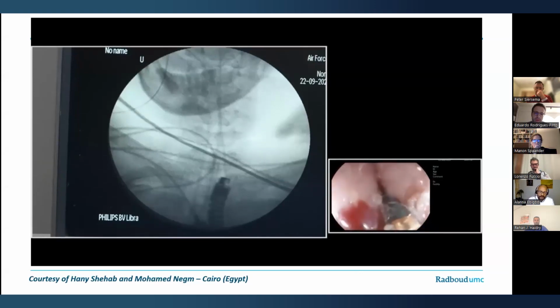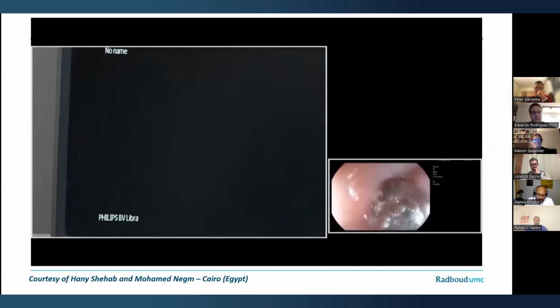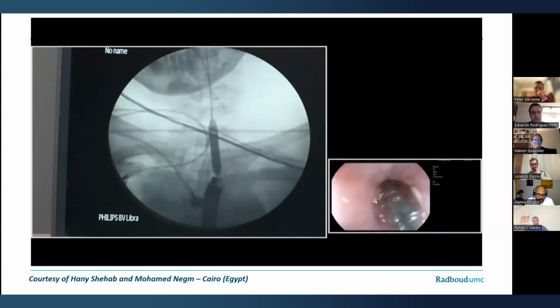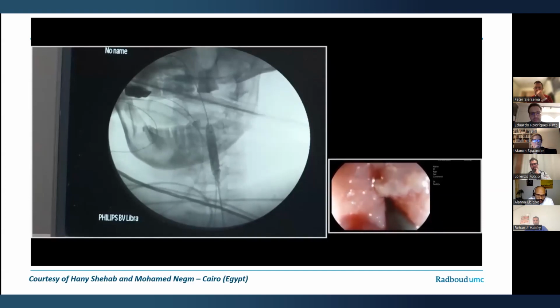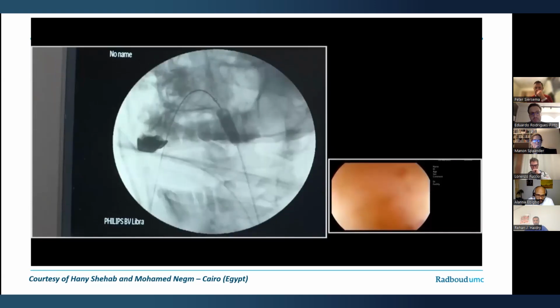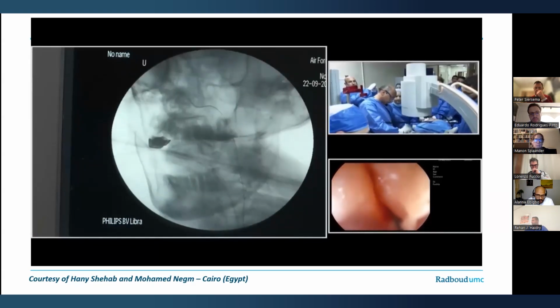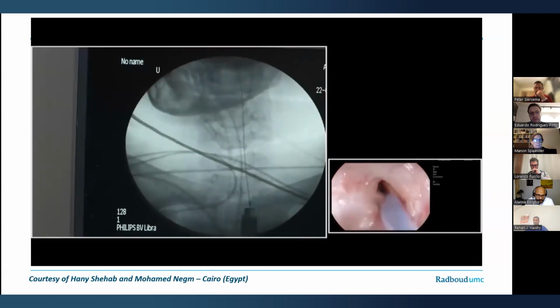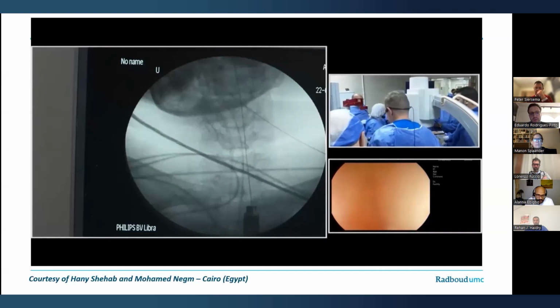So, I'd like to start again all over. Just 1 minute. Midway, all the way. You can see it. Yeah, there you are. Oh, it's come through? Yeah, you're going inside the channel now. How far is it in the stomach now? Oh, this is in the endoscope. It's in the endoscope now.